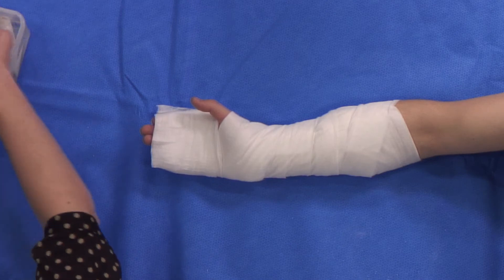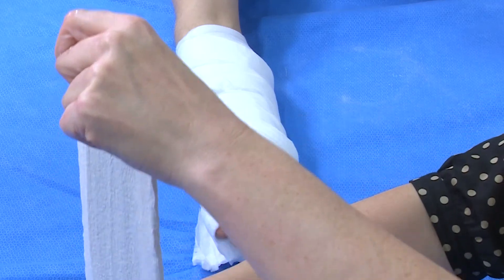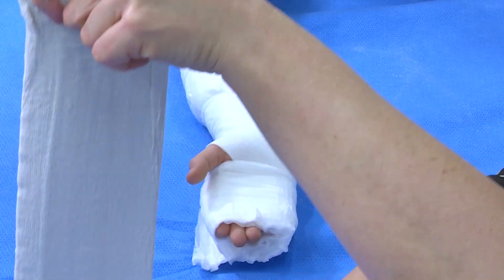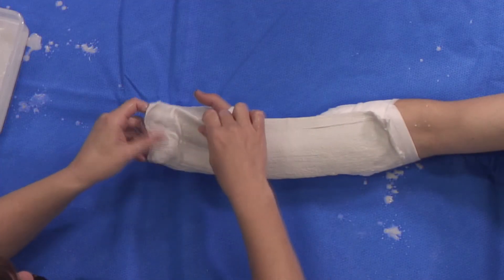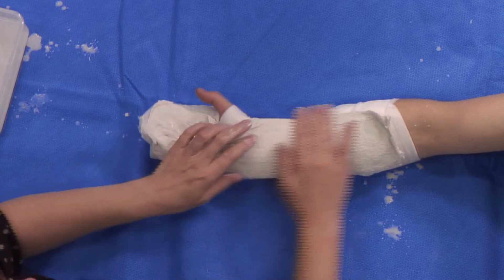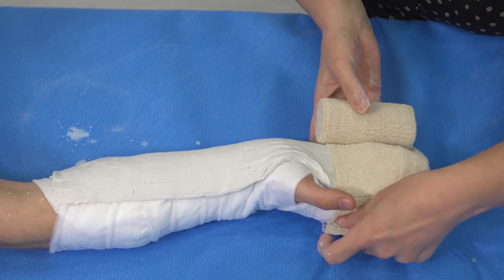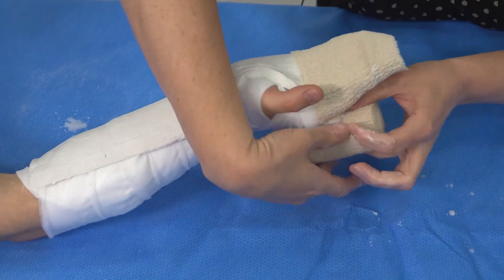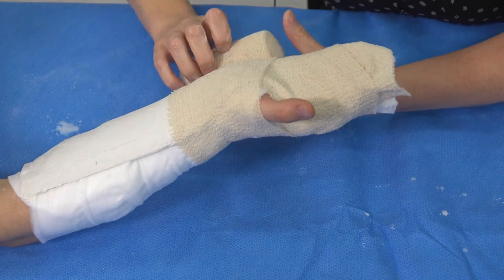We'll dip our Plastercast and lay it on, making sure it goes to the fingertips. You don't want it to cut across the thumb. We secure it as quickly as we can so that we can get onto the moulding before it's set too much.